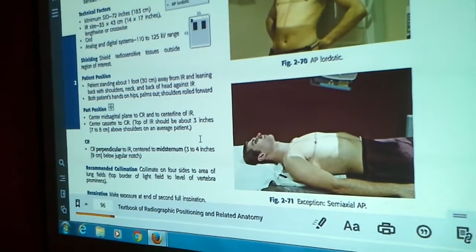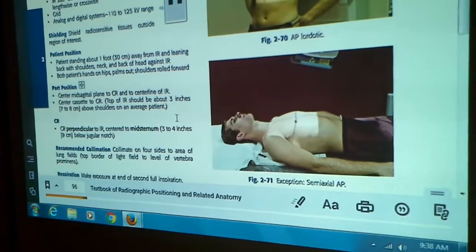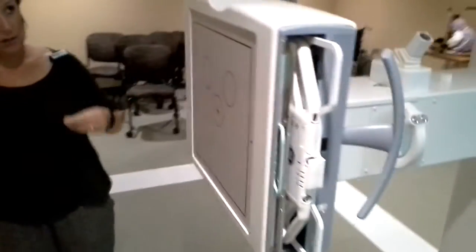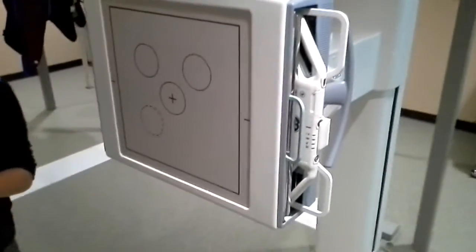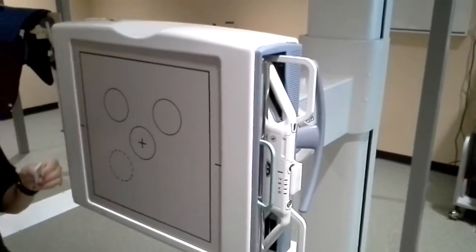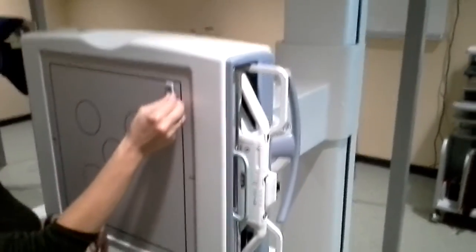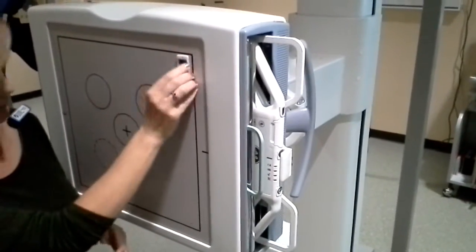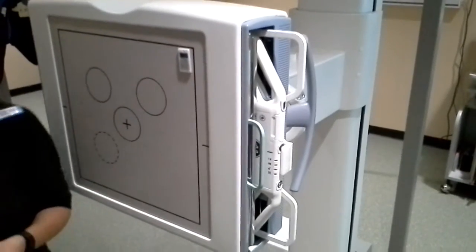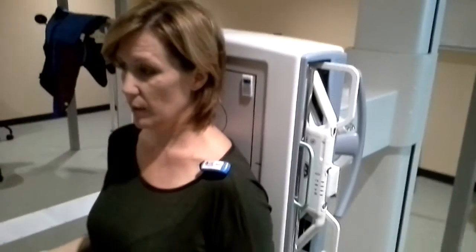And that's because everything is projected up, but remember that's a guideline. Sometimes that 3 inches is going to be a little too much. Okay? So we want to make sure that everything is set up here first. See that the patient is going to be AP now, so for PA chest x-rays we put our left over here, but since the patient's going to be facing out, this is the left. So we're going to place our left marker in the upper corner, and then what we would do is instruct our patient to stand so their back's up against the board here.